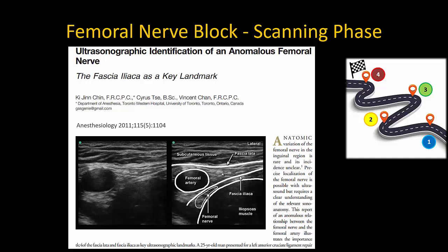Recognizing the fascial layers is a vital step because the femoral nerve can sometimes lie unusually close to the artery. We first reported this in 2011, but I have since observed it multiple times. It occurs most often in patients with well-developed muscles, presumably because the hypertrophied iliopsoas bulges medially to push the femoral nerve against and sometimes even under the artery. The most important thing is not to mistake the hyperechoic area between fascia latae and iliaca for the femoral nerve.